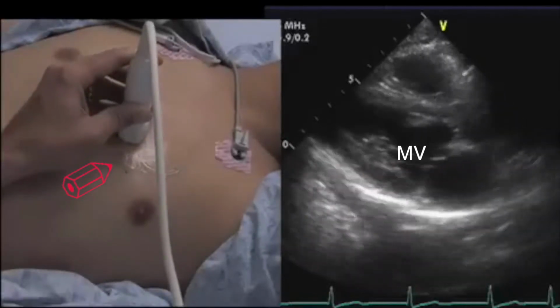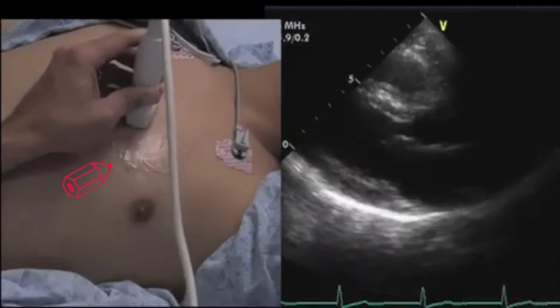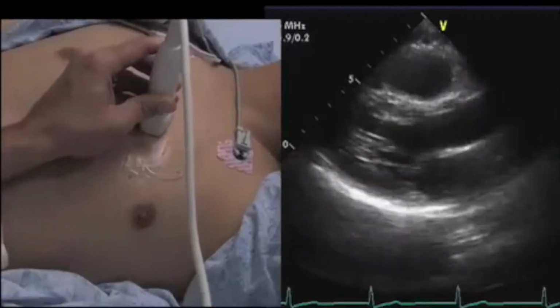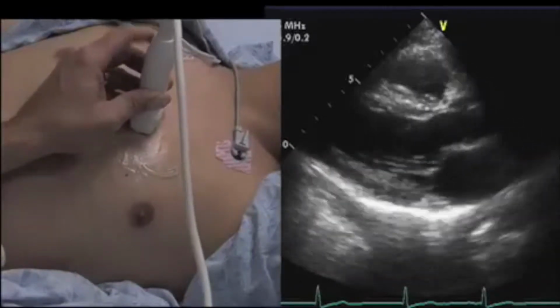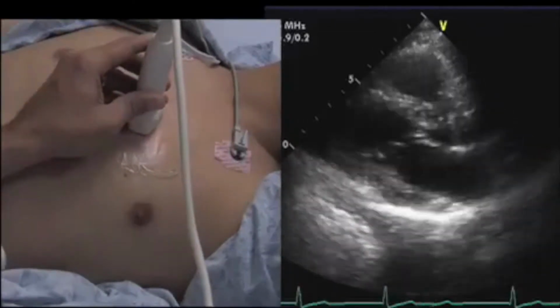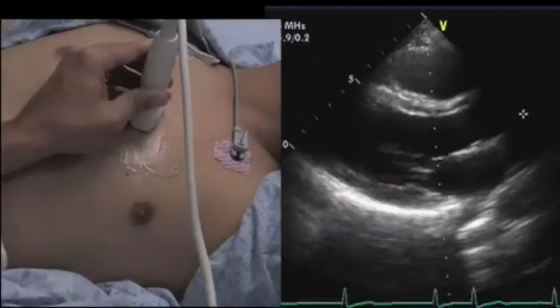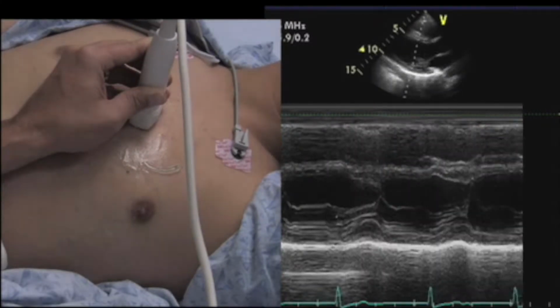See how the ventricle is getting flatter now and flatter still. And now I can do my circle where I'm at, where I have a nice flat ventricle, and fine tune that image. And now I've got a good parasternal long axis view. Now it might not be as pretty as the lower view was. It might not have the aesthetics that we'd like to see. So in that case, you want to go ahead and do your M mode from this flat window, so you're sure you've got a nice perpendicular M mode.